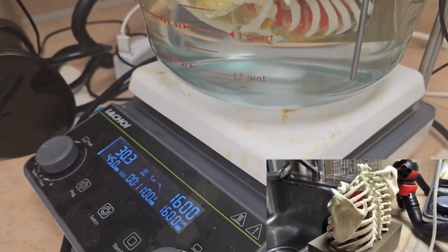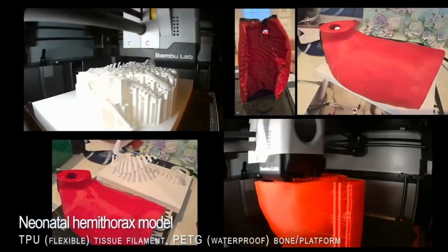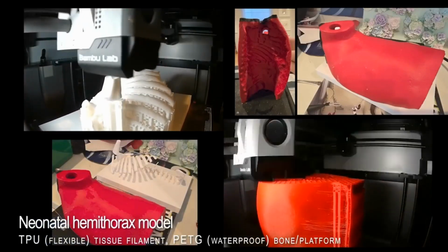Now, these are just small figures that I make for some of my patients, but what's exciting about this is the possibility to create tailored simulation tools for some of the more complex congenital problems we take care of. So for example, here's a neonatal hemithorax model created from a CT scan.